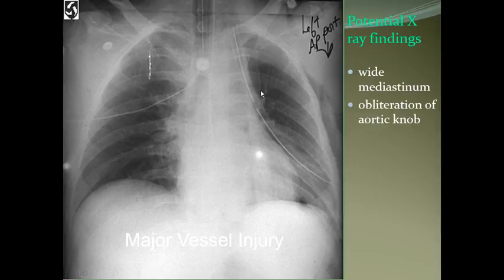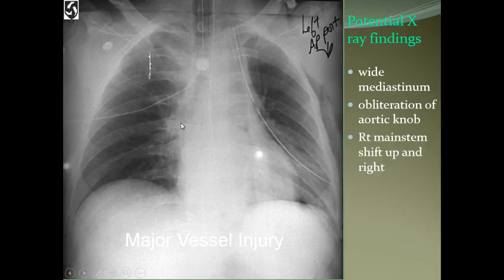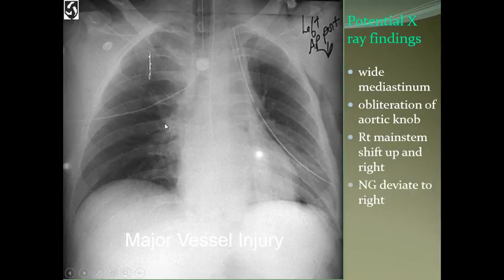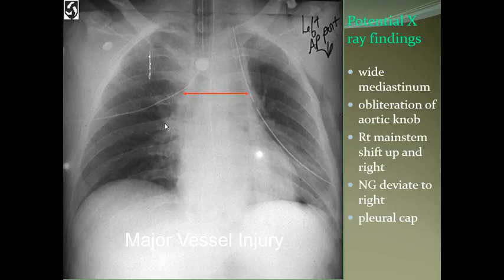There is a widened mediastinum — you have to comment on this. There is obliteration of the aortic knob; you cannot see the aortic knuckle. The right mainstem bronchus is somewhat elevated and the NG (nasogastric) tube is deviated to the right. There is also a pleural cap sign.